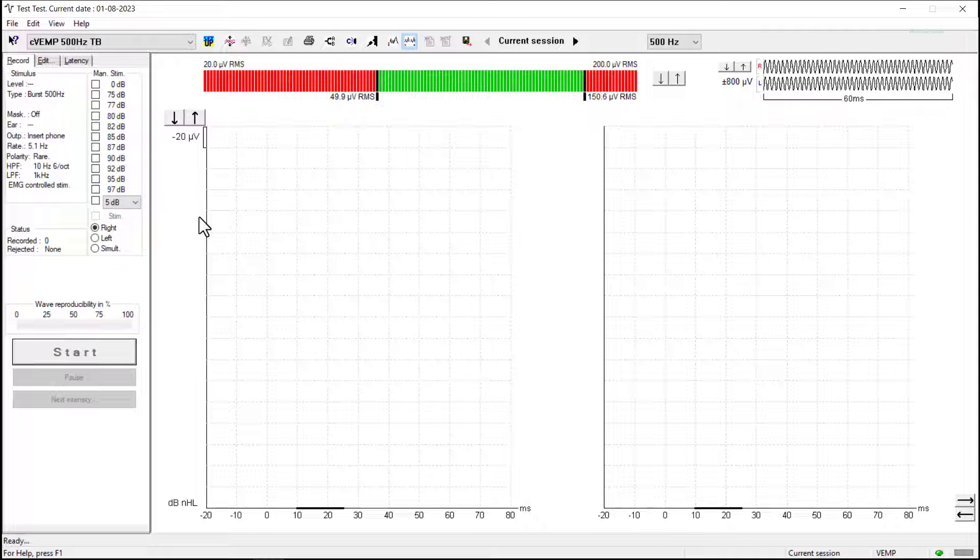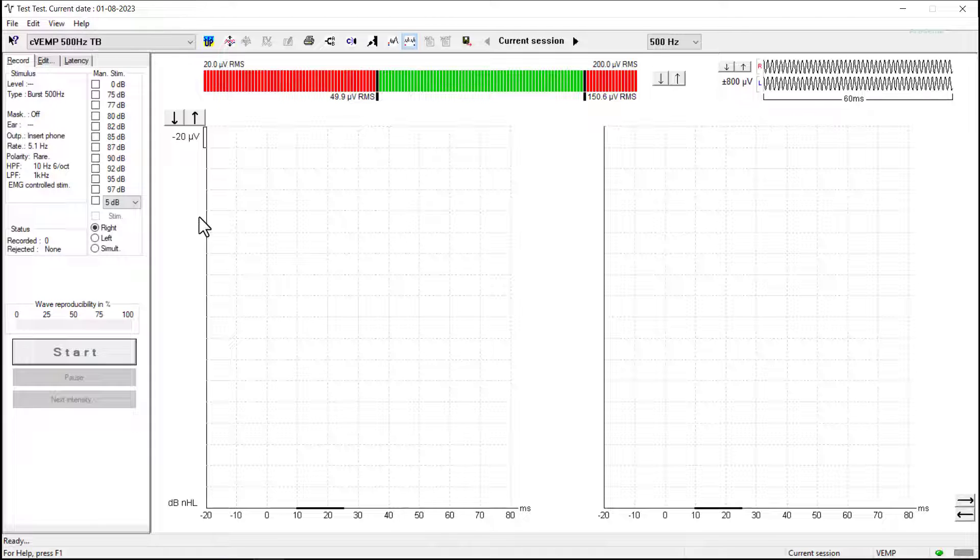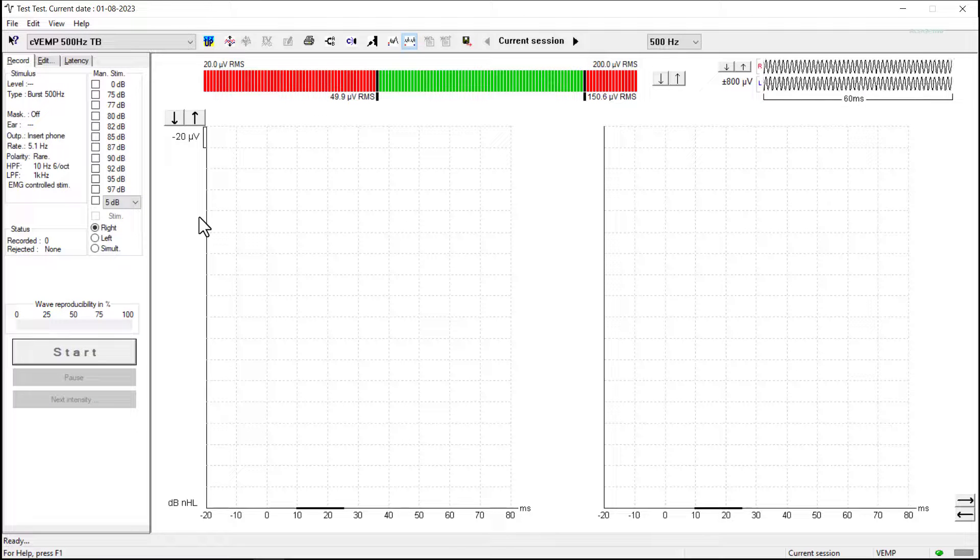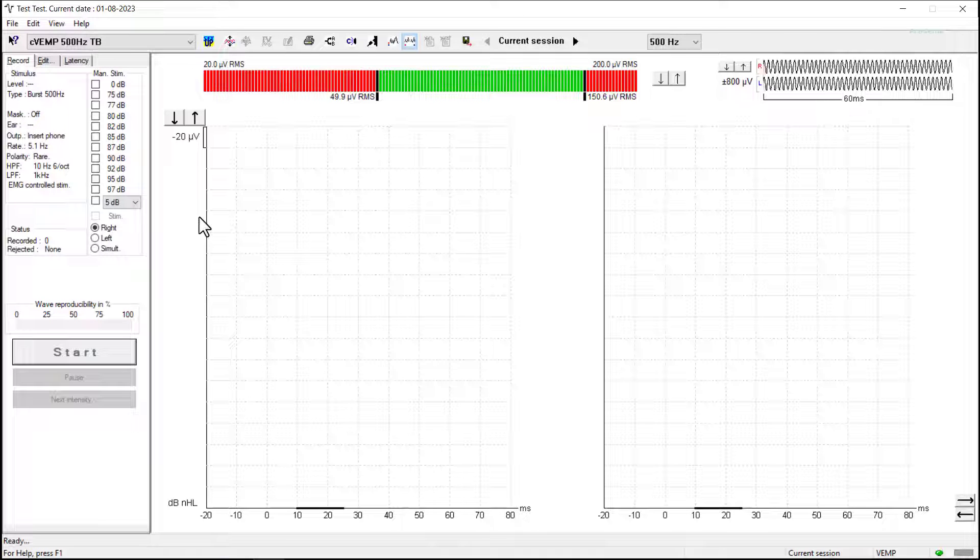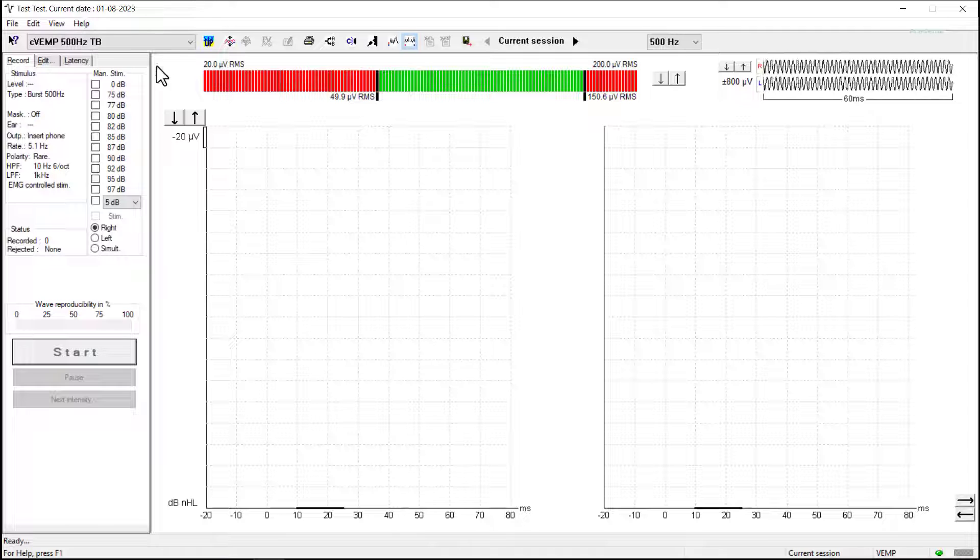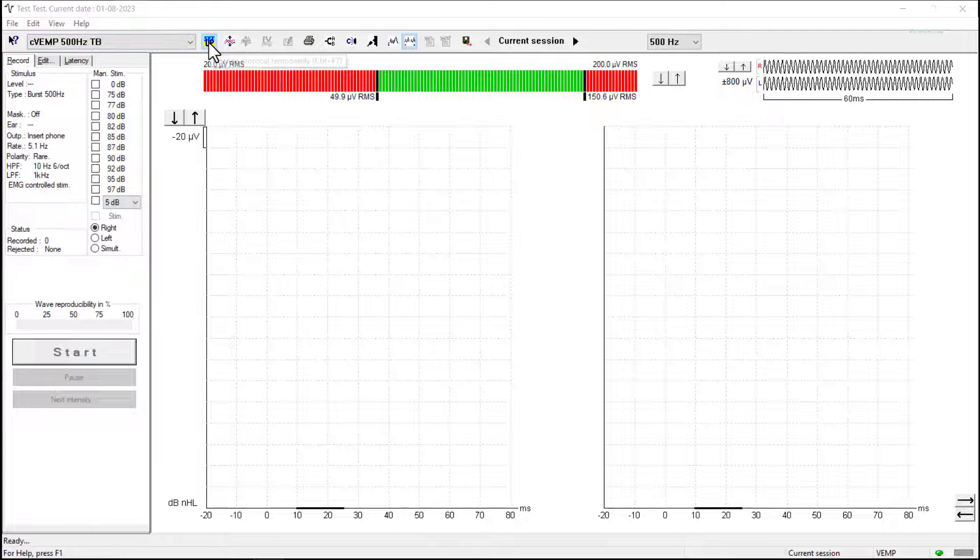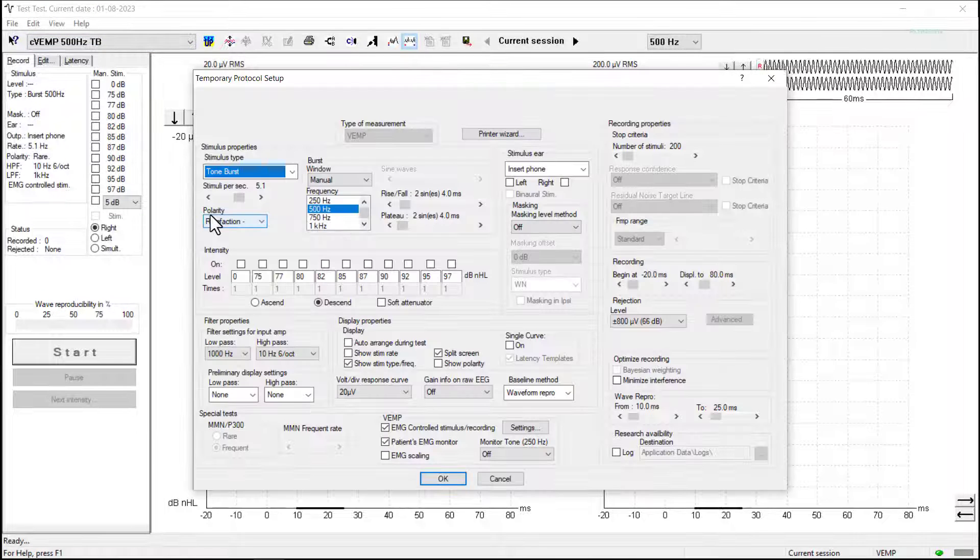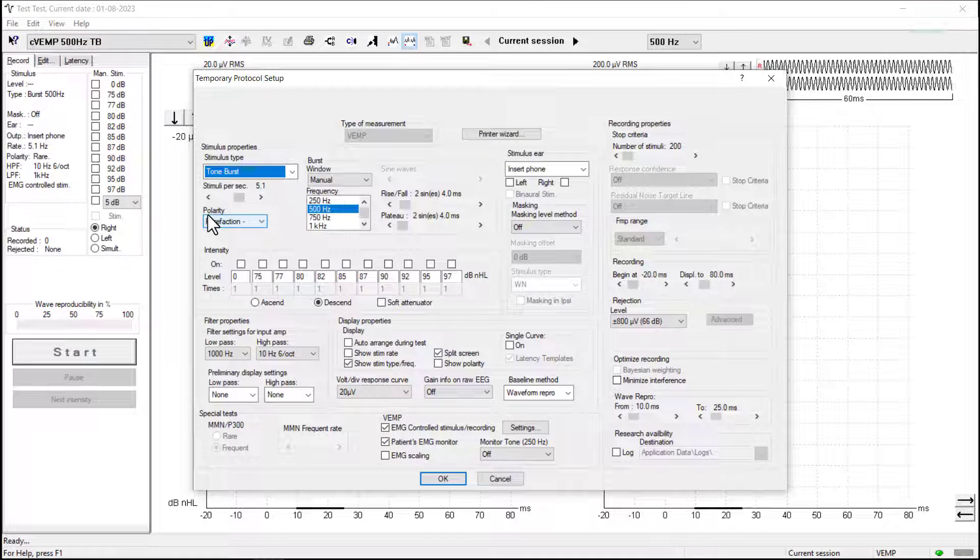With the Eclipse software open, we can take a look at our C-VEMP protocol. There is a default C-VEMP protocol, and if we click on temporary test setup, we can look at the parameters within this.